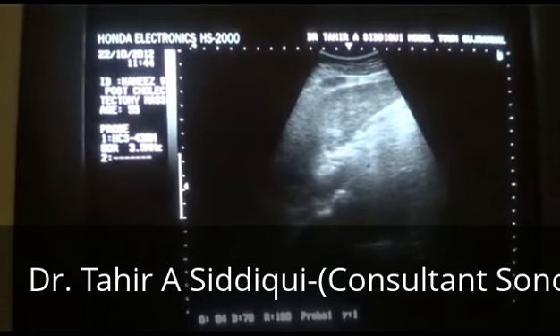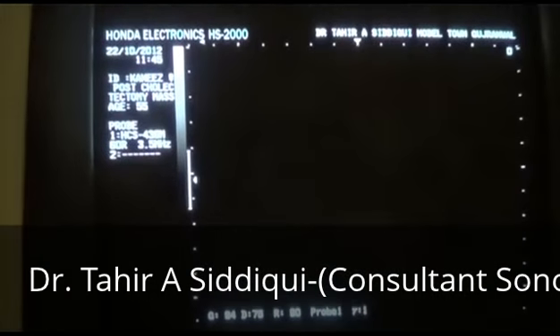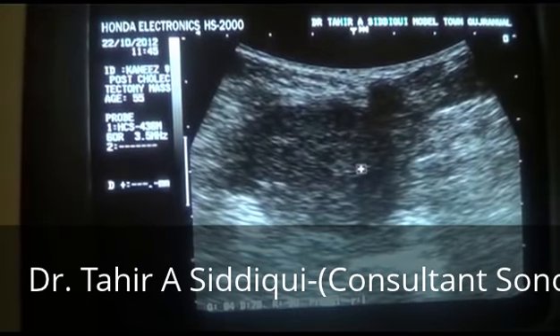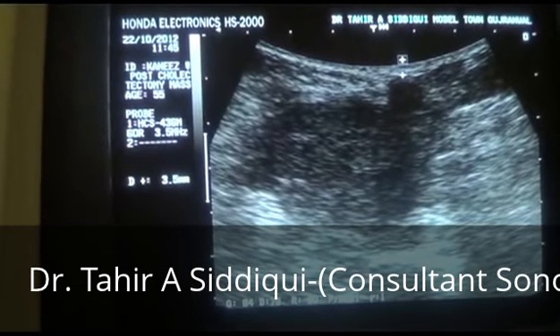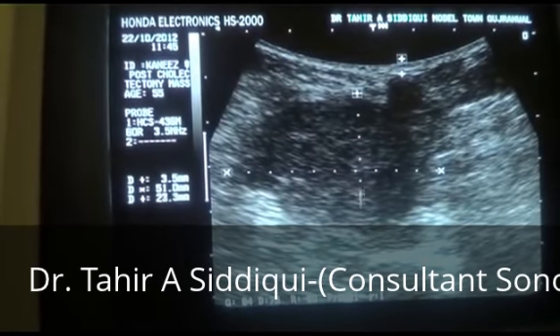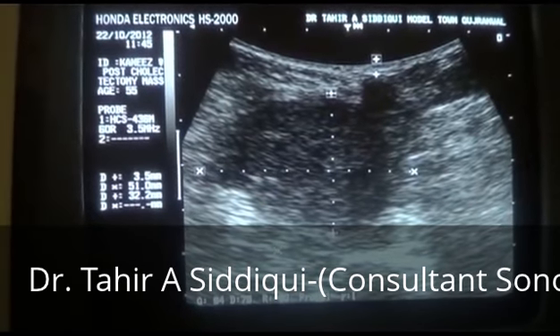Now let's come to the area of the mass. At the hypochondrial region, just 3.5 millimeters below the skin, in the region of the right hypochondrium, it's a hypoechoic solid mass, as we do not see significant posterior acoustic enhancement.